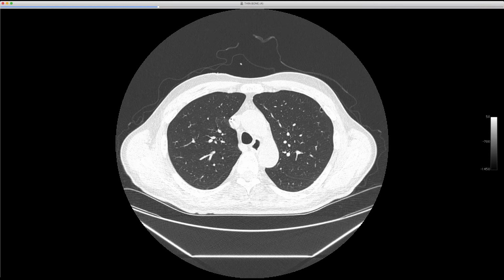That's very helpful. I've seen the colon cancers do it recently, especially some of these mucinous tumors when they get treated. And I wonder if it's a similar phenomenon. They stop producing mucin, so they cough it out, and it kind of disappears, and you're left with the rind. Well, that's helpful. Okay, good, because none of us had seen that phenomenon before. We don't see a ton of metastatic, because the bladder cancers I've seen are just little tiny nodules. They metastasize, and I think a lot of them, I don't think they scan them as frequently.